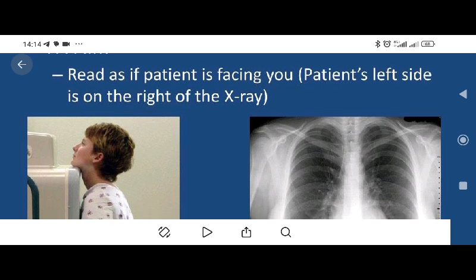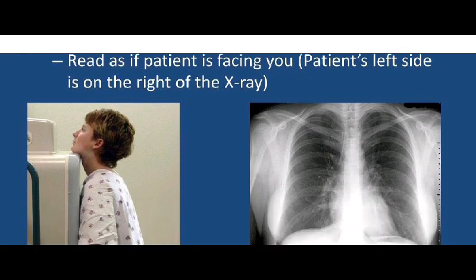And also, people normally use the heart to identify, because we all know that naturally the heart should be on the left side, but that is a lie, because not everybody's heart is on the left side. That's what we call dextrocardia, where the heart is shifted to the right. Do you understand? It's not a must that the heart will be on the left. There are people whose heart, by nature, is on the right, and it's not actually pathological. It's not based on some embryological deformity. Let me say, it's just nature. It's not really pathological, it just happens that way. So you don't use the heart to judge that this is right and this is left.